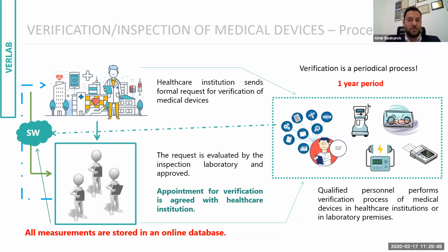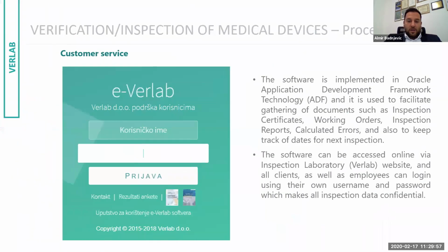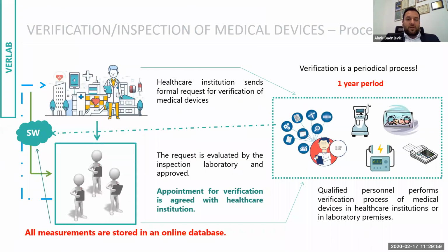they write the results immediately in software, which is in fact an online database. So now we not only measure directly there, we have in real time the change of all of those parameters, and we have the measurement in each metrology point of each of these medical devices from year to year. Because when a medical device, or any kind of device with a measuring function, is part of legal metrology, then per the law, you must do annual verification or inspection of those devices by an appointed and accredited laboratory.